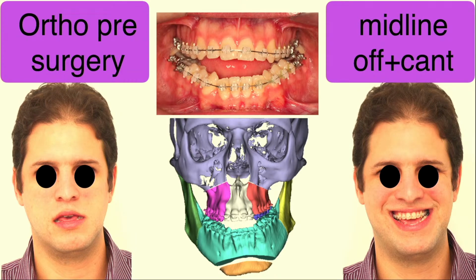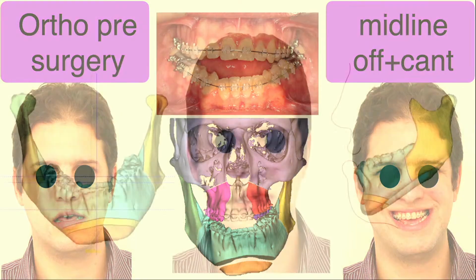So here is our patient. If you see this patient after the pre-surgery orthodontics, you can understand what happened with this patient. When we started to prepare this patient orthodontically, you can see that the soft tissue is a lot more relaxed, and the patient shows more skeletal discrepancy. It is more clear when you are ready to do surgery.